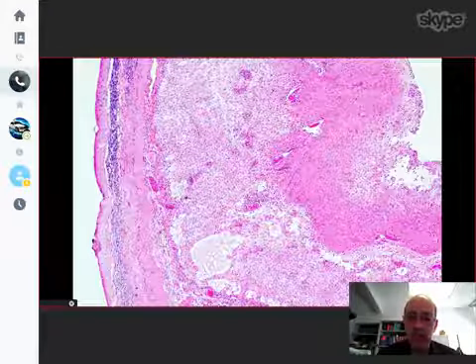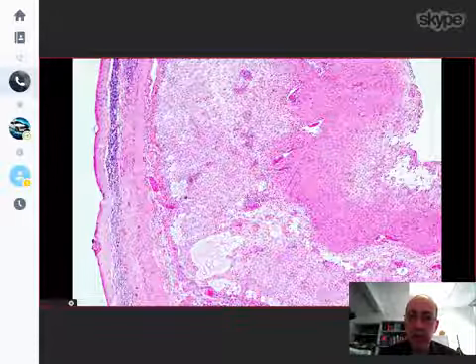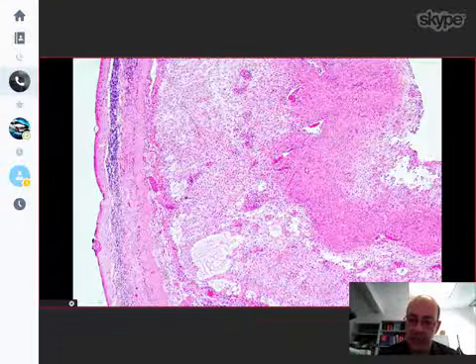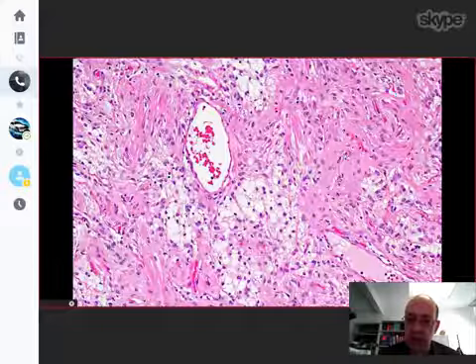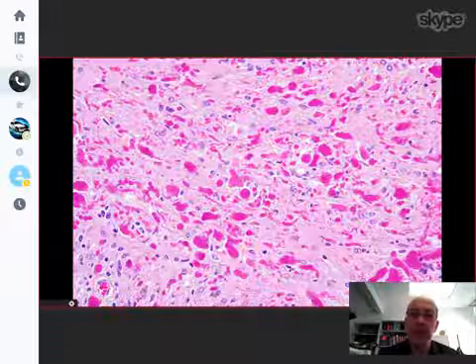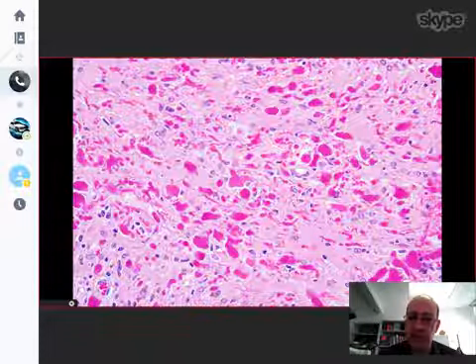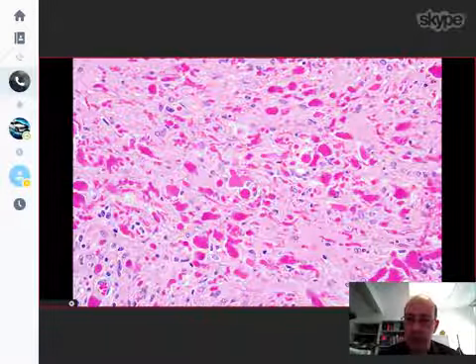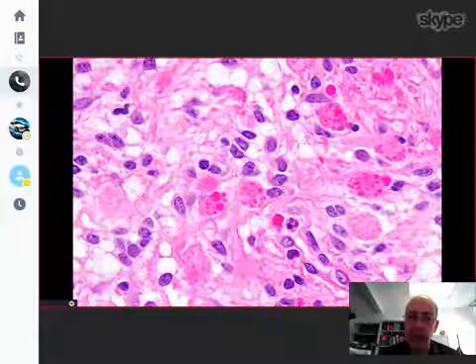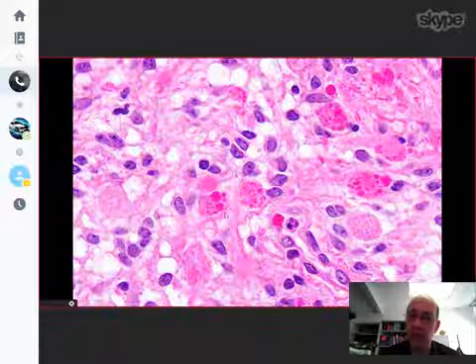The classic case has this biphasic appearance with loose microcystic areas alternating with dense compact areas. As you see here at higher mag, compact, loose. And in the compact areas is often where we find these Rosenthal fibers with elongate eosinophilic corkscrew-shaped structures and eosinophilic granular bodies, which are analogous but more mulberry-shaped. We tend to see most often in the loose component, as you see here.